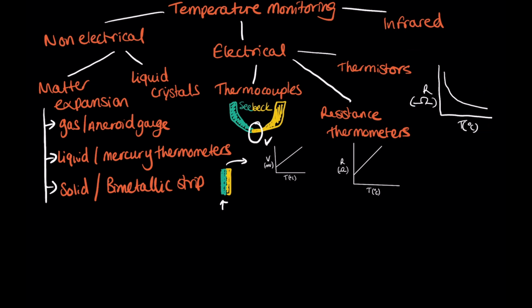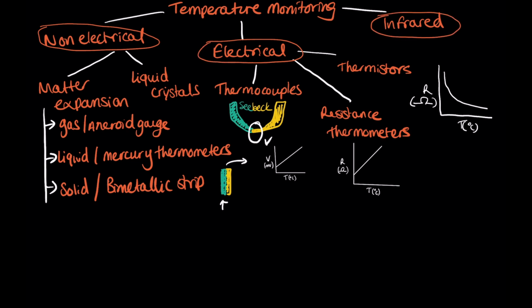Thermistors are commonly found in cardiac output measuring devices, where the change in temperature over time is measured to estimate cardiac output. A thermistor is also what's found at the end of an esophageal temperature probe, which we commonly use in anaesthetic practice. When I was revising for my final VIVA, I was told by an examiner who had more than 15 years of experience examining that even in the final you are expected to be able to reproduce these graphs, so it's important to practice them.